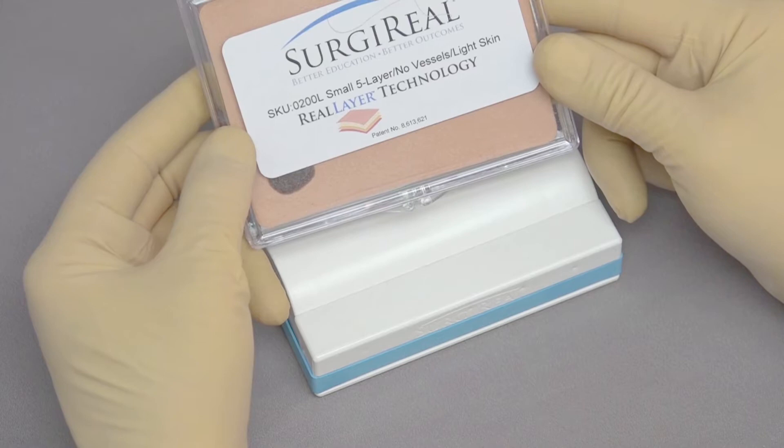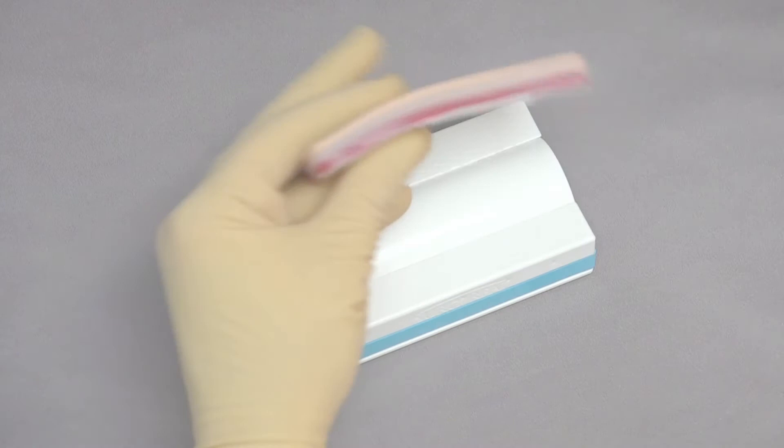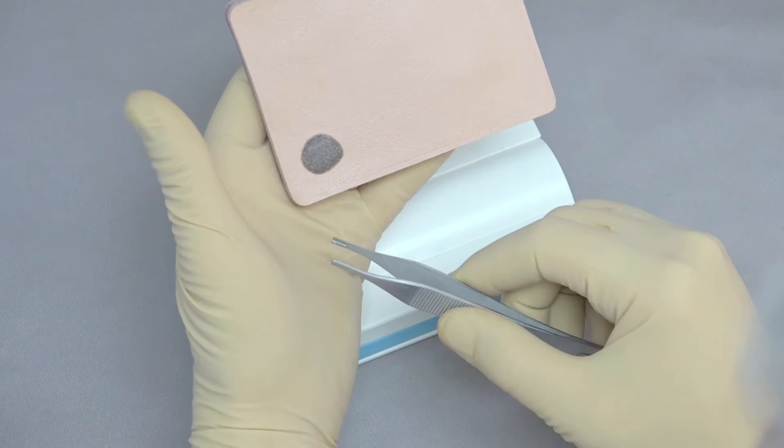We're going to be suturing with the SurgiReal small five-layer light skin pad. This pad is designed to replicate the layers of the body wall — specifically the skin, the subcutaneous, an external fascial layer, muscle, and internal fascial layer. This one also has a mole, so you can practice using it for biopsies or resecting the mole.